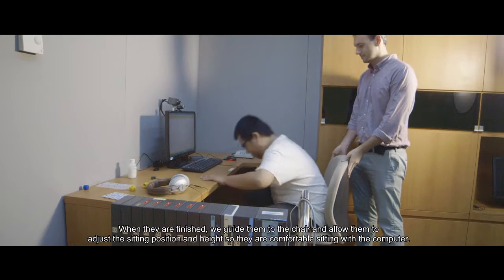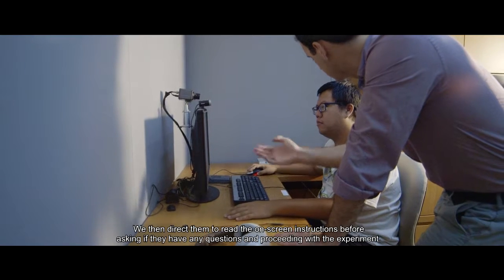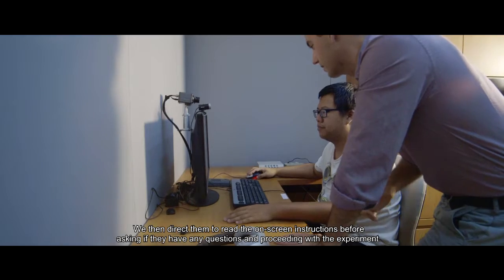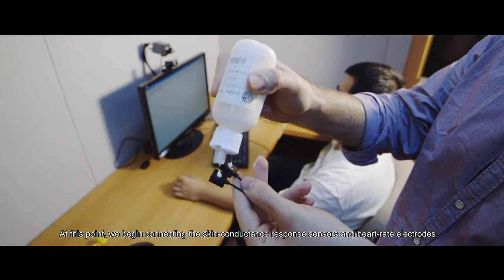When they are finished, we guide them to the chair and allow them to adjust the sitting position and height so they're comfortable sitting at the desk with the computer. We then direct them to read the on-screen instructions before asking if they have any questions and proceeding with the experiment. At this point, we begin connecting the skin conductance response sensors and heart rate electrodes.